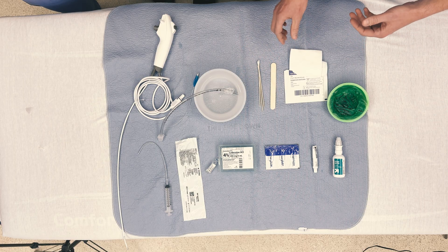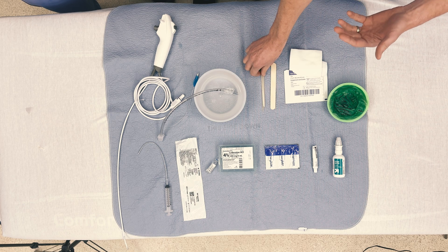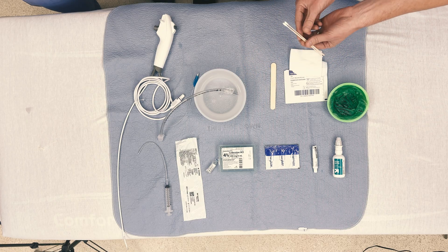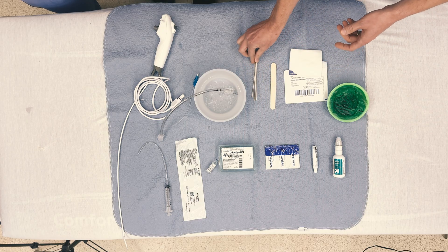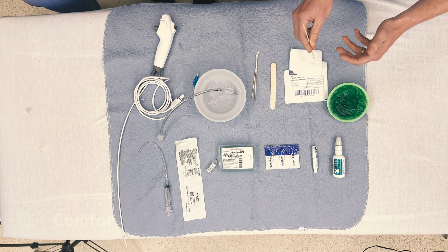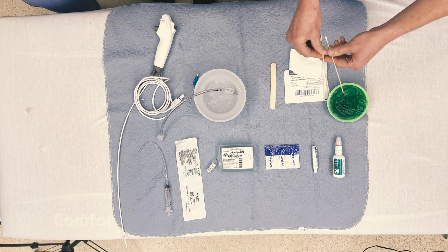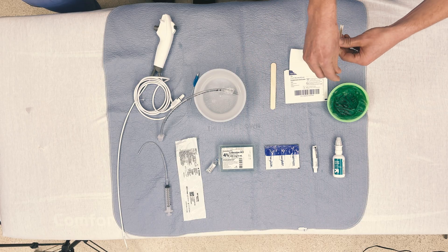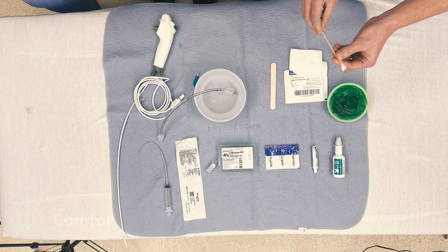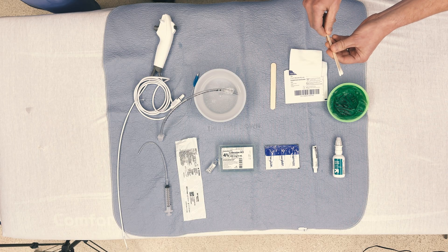If a patient is having a hard time while awake accepting the finger dilation or the tube into the nasopharynx, we sometimes find it helpful to use long cotton applicators. Starting with one coated with lidocaine cream or viscous lidocaine, it can be passed the length of the nasal passage. A second can be added, and finally a third. When all three are passed together, they sit in the back of the nose and continue to provide anesthesia while the mouth and throat is being prepped.